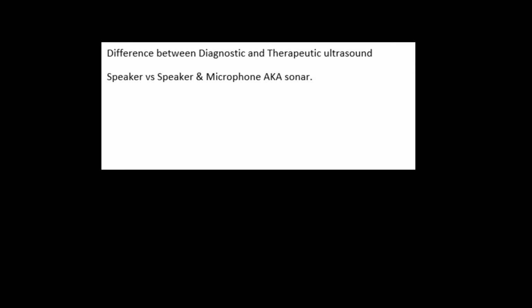Your diagnostic ultrasound is both a speaker as well as a microphone. So it works much more like sonar, where it sends a pulse of energy out and then it listens, waits to hear the echoes, some magic happens, and then a picture appears on your screen. I don't know how the magic works, so God bless the people that figured it out.